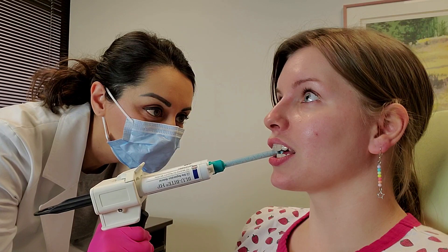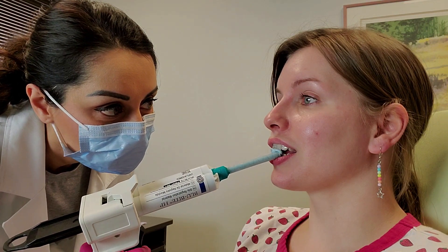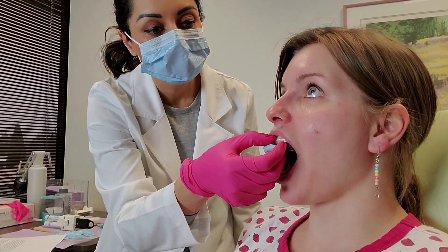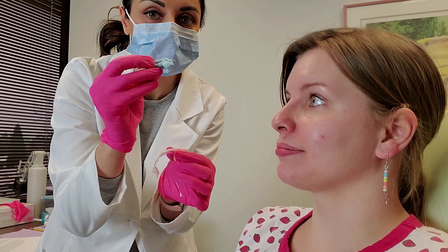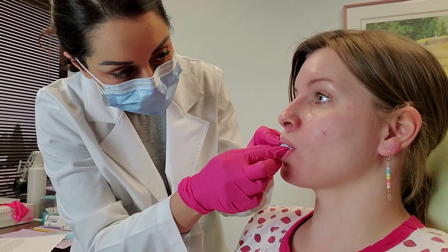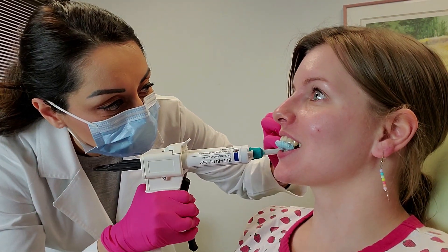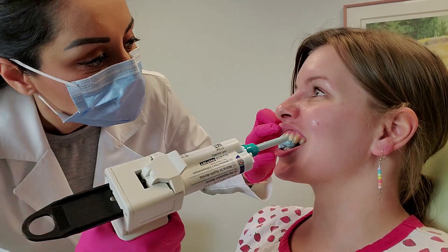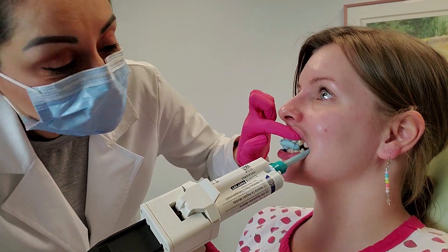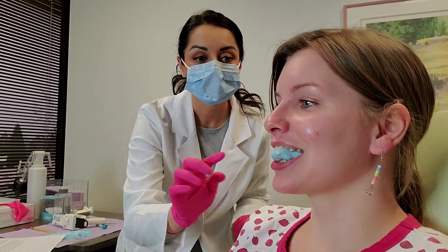You and your assistant will start to recognize a position that the jaw goes to as the patient slowly counts. Once you feel you've found a consistent place and/or the wear facets line up, ask the patient to freeze. Then, making sure your patient is as upright as possible, place the blue bite registration in the anterior portion where the Aqualizer pads are not resting between the teeth. Let this set, then remove all of it — the Aqualizer and the anterior jig. Place the anterior jig back in, have the patient line their lower teeth up into it, then fill in the posteriors on the right and left. Be sure to stitch the set and unset material together, let that set, and then you have your Aqualizer bite that will help to treat the muscles, the joints, and the ligaments.